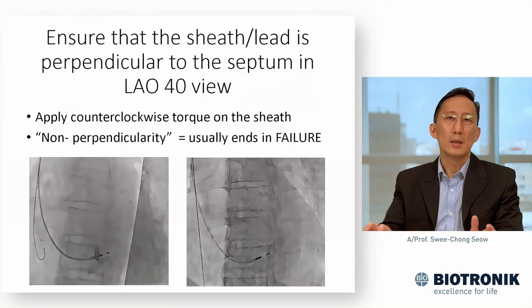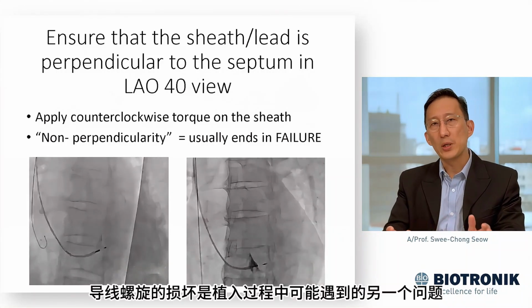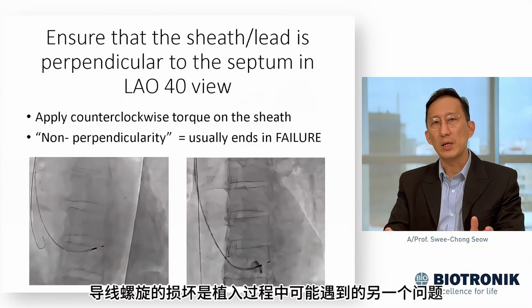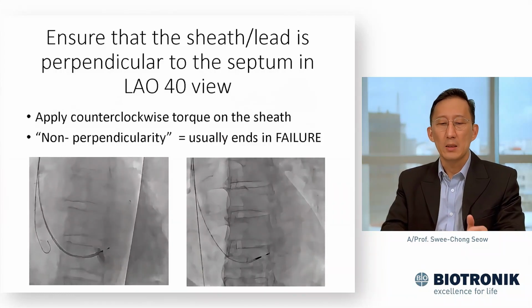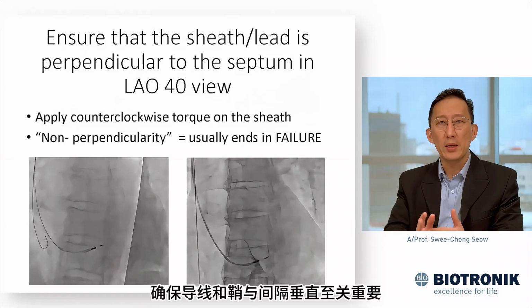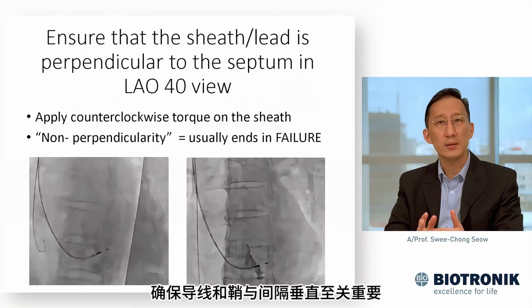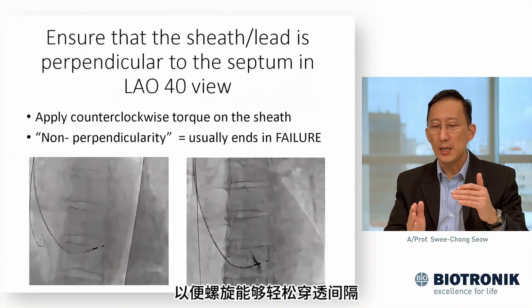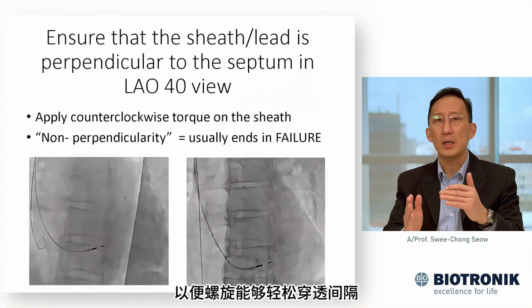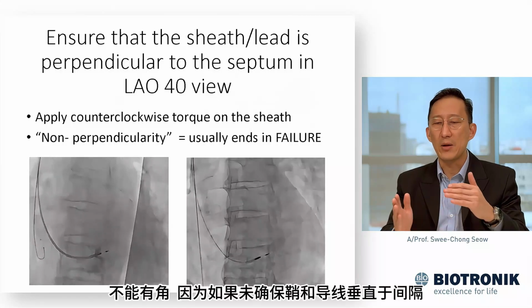And the damage to the helix is another issue that we come across during the process of implantation. It is important to make sure that the lead and the sheath are oriented perpendicular to the septum so that the helix can penetrate into the septum easily and not at an angle.